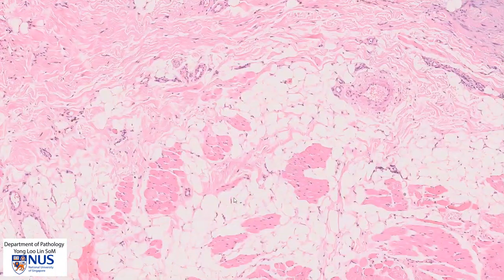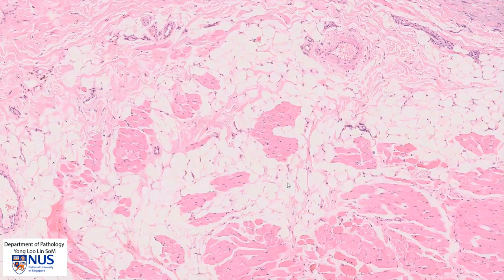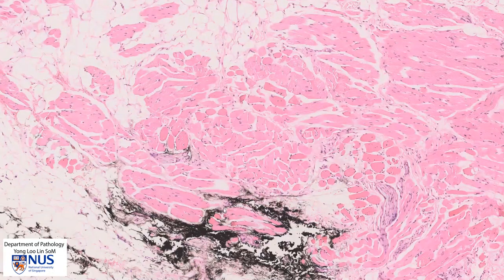Moving down we have the subcutis, which is composed of adipose tissue. There is also some skeletal muscle here, and this is not part of the skin.